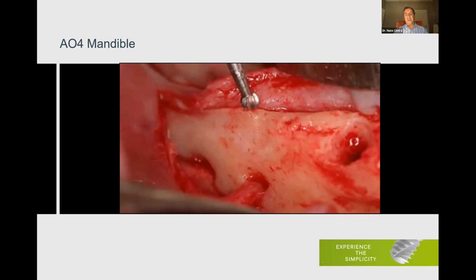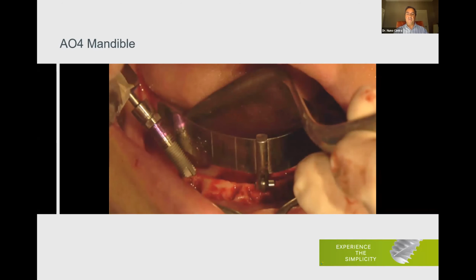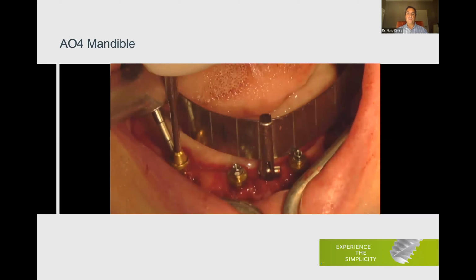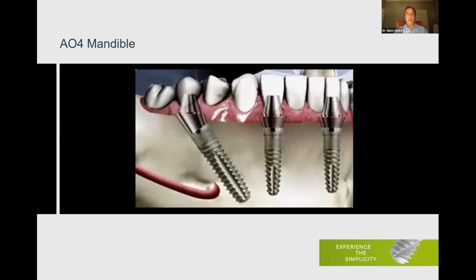So if we have a crest that allows us to start above and behind the nerve, by tilting the implant 45 degrees, like we are doing here with this preparation, starting above and behind, tilting 45 degrees, we'll be in front of the nerve. So we'll be safe, because the 45-degree angulation allows us to be in front of the nerve. And then again, we compensate that angulation with a 30-degree abutment, which should be placed with the help of the guide. So this is what we are looking for. As you can see, we start above and behind, so we reduce the cantilever and we are in a safe position in front of the nerve.